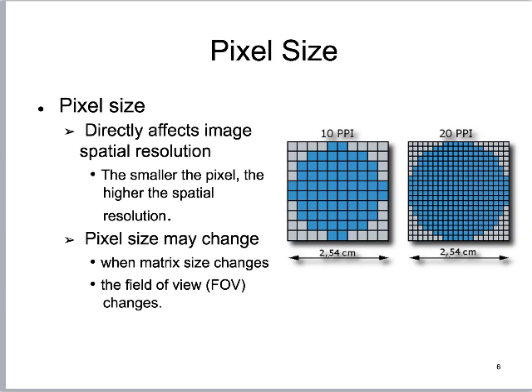But the closer and closer you get to them, the more and more detail you see, and all of a sudden you start to see all the warts and the wrinkles or whatever, right? So that's the same thing happening. It's literally happening with the human eye, that as you get closer to something in real space, everything about that thing starts to get bigger.